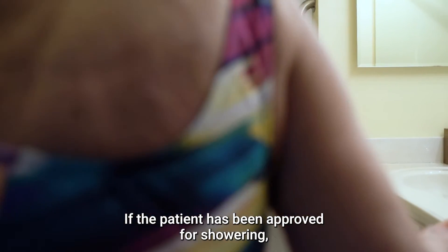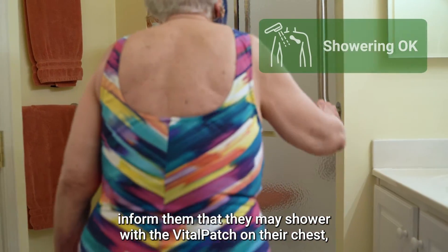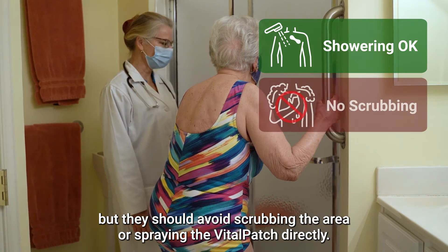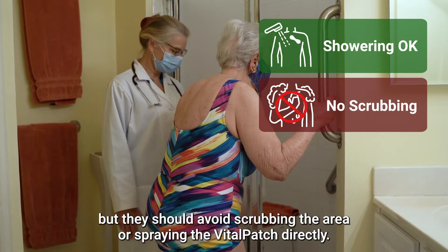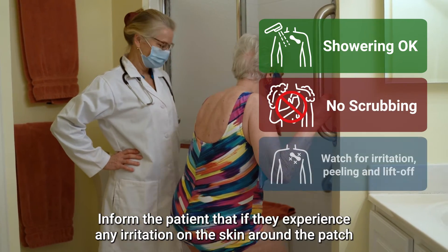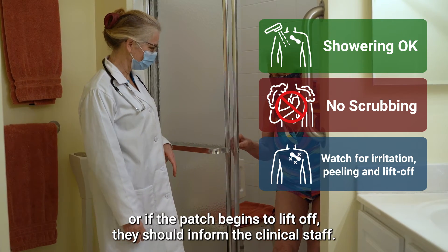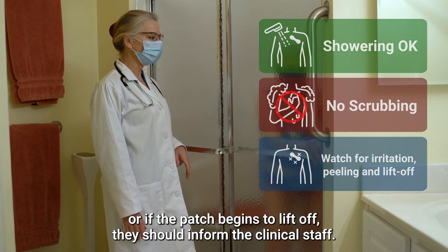If the patient has been approved for showering, inform them that they may shower with the Vitalpatch on their chest, but they should avoid scrubbing the area or spraying the Vitalpatch directly. Inform the patient that if they experience any irritation on the skin around the patch, or if the patch begins to lift off, they should inform the clinical staff.